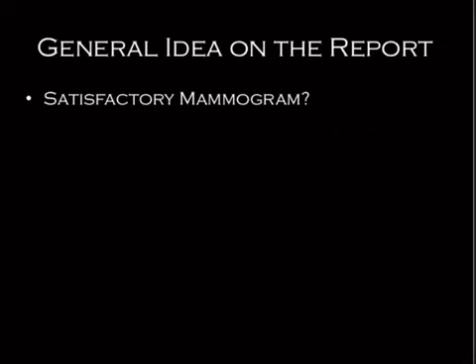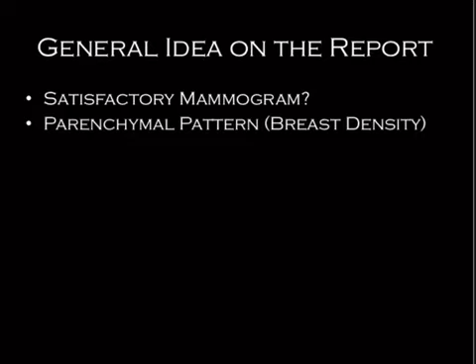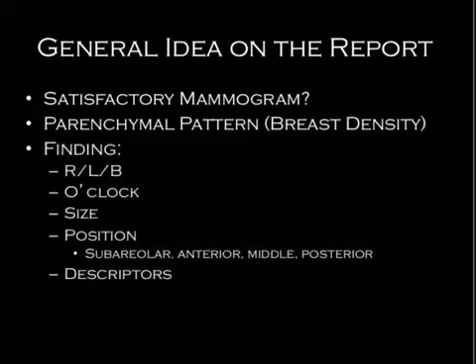Now, the general idea on how the reports work is, first thing is whether or not it's technically sufficient. Second thing, like I said, is you have to describe the breast density. Is it fatty, kind of fatty, mostly fatty, or totally dense? Is there a finding? What breast is it in? Remember the clock face, measure it, location, and then the other vocabulary word descriptors. And then you end up giving a BIRADS, which is going to be a 0, 1, or 2 off of the screening. And then it's going to be a 1, 2, 3, 4, 5 off of the diagnostic.